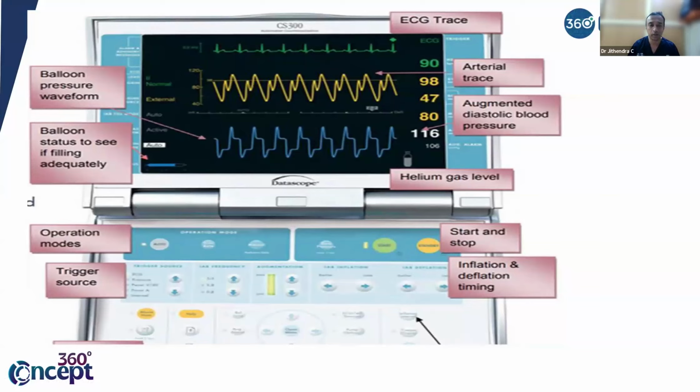So what is augmentation? Anybody wants to tell? You can write it in your chat box. This is 1:1 augmentation. You can see every wave there is augmentation. So that is 1:1.